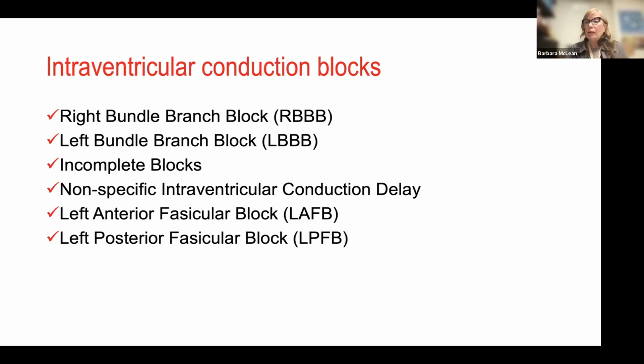Now, when we look at intraventricular conduction blocks, we talk about right bundle, we talk about left bundle, we talk about incomplete blocks, and incomplete really lends itself to one small fascicle, the left anterior or the left posterior fascicle being non-conducting and therefore changing the activation direction, but not actually prolonging time. So activation direction is going to change, but not time. And this can be very confounding for people who aren't that interested in cardiology, or you're in the ER looking at an EKG and you're seeing some changes that are worrisome to you.